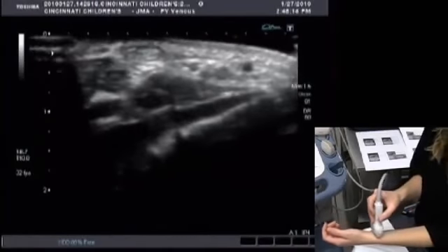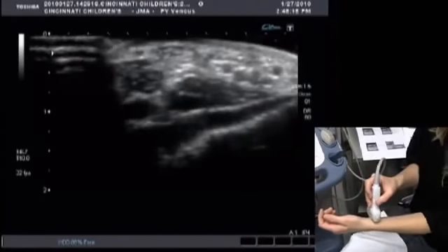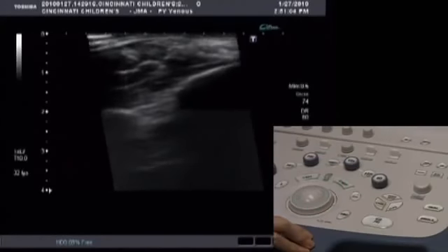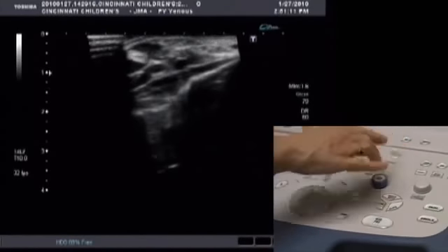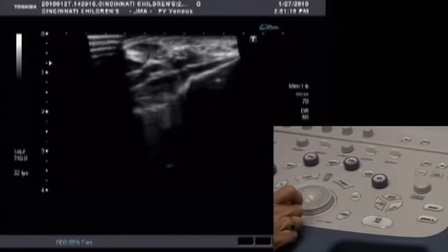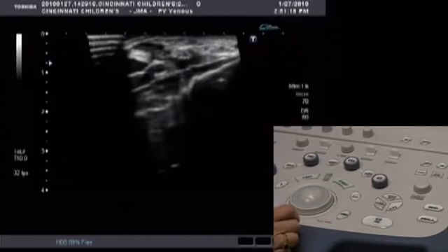Scan your wrist in the AP axis. Without pressing too hard, you will compress the radial artery. Now we're going to optimize the image: use the 2D focus to put the focal zone in the area of interest — that's the small triangle on the left-hand side of the screen. Then press Quick Scan or Q-Scan to autofocus the image.